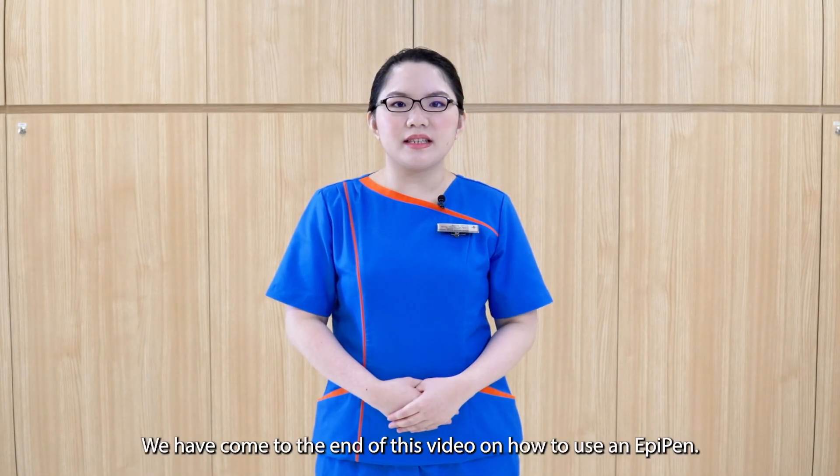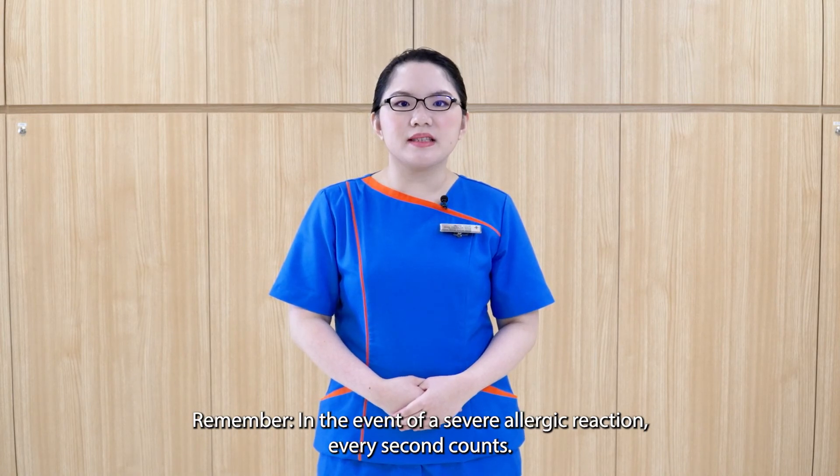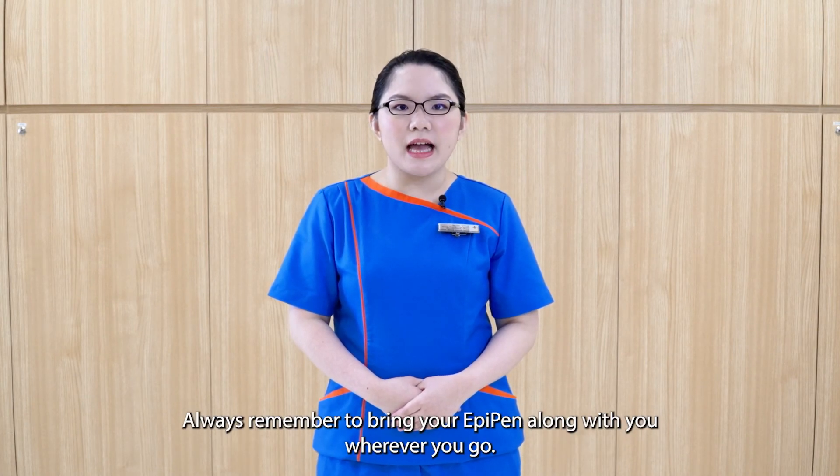We have come to the end of this video on how to use an EpiPen. Remember, in the event of a severe allergic reaction, every second counts. Use the EpiPen immediately and call 995 for an ambulance. Always remember to bring your EpiPen along with you wherever you go.